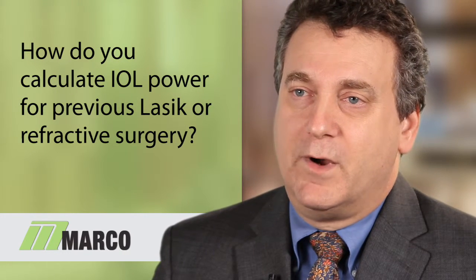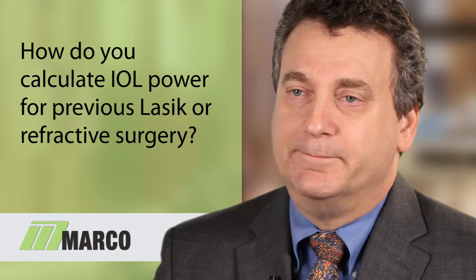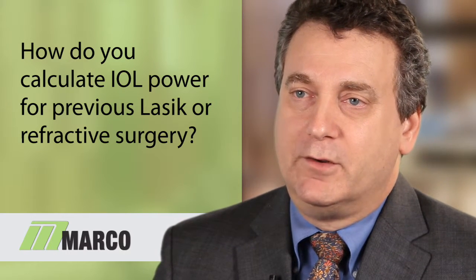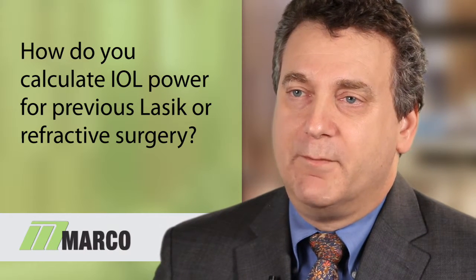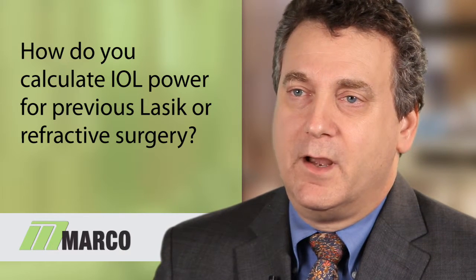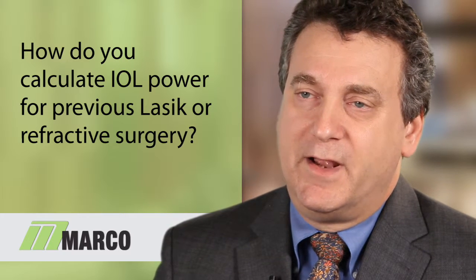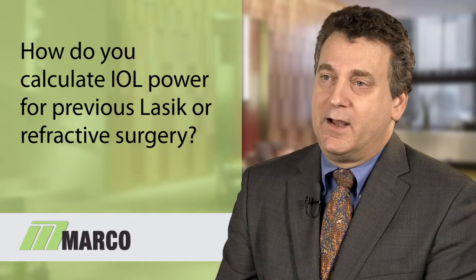But the other reason why I like to have the OPD scan, in addition to just the average pupillary power, or APP, is I think it's really important to look at the corneal topography in these patients. I'm always impressed at the number of people who've had prior laser vision correction that do have a permanent corneal cylinder etched into their cornea, presumably to treat a compensatory lenticular astigmatism. And when you take their cataract out, that corneal astigmatism will then become manifest.